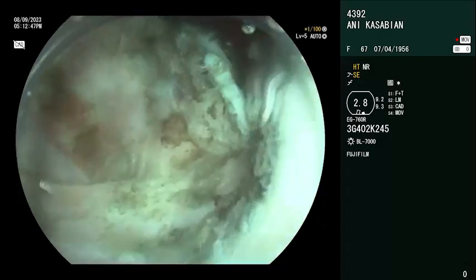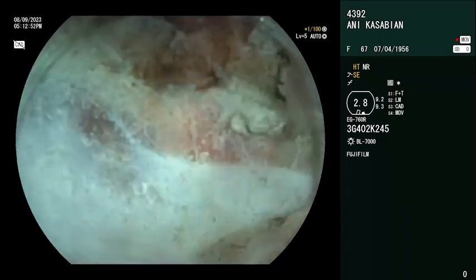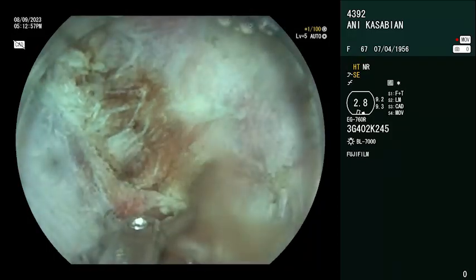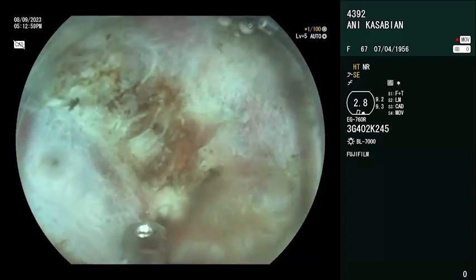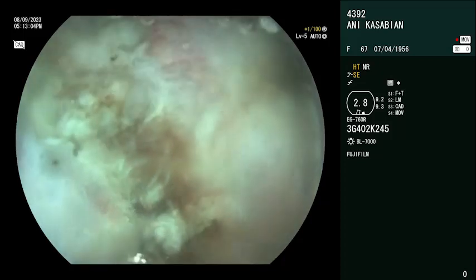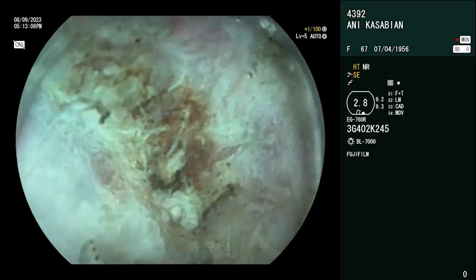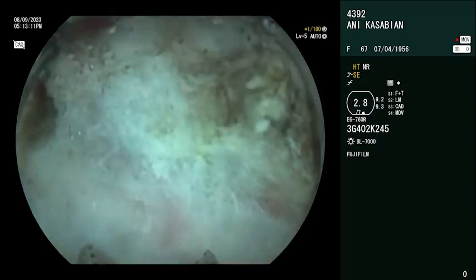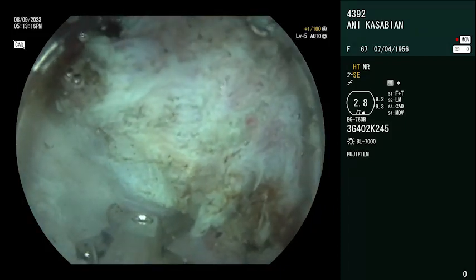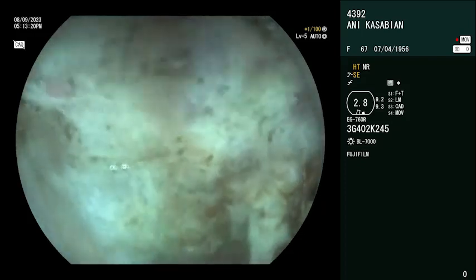Underwater, it also works really nicely. Open, close. Of course, if you have this kind of bleeding and fibrotic lesion, it's a longer procedure time. Unexpected, but that's why for beginners I recommend to take your time.